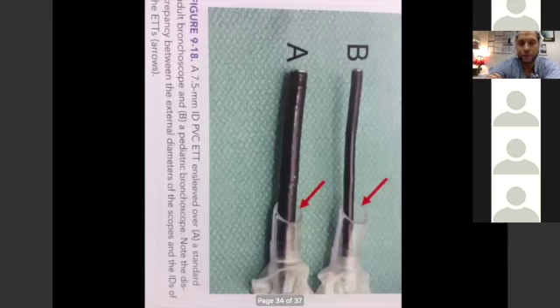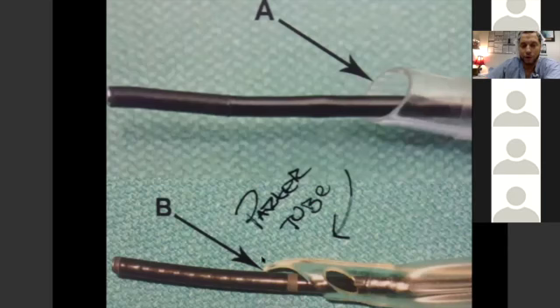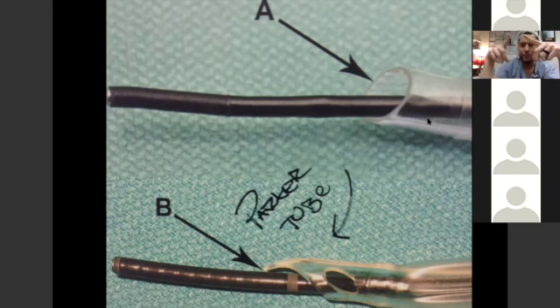Now, we have a tube, Georgina brought it for us, helped us order it. It's called the Parker tube. And the Parker tube hugs the fibroscope. So you see how this part in A would get caught up on the cords? The Parker tube will stick to the fiber optic scope and allow it to enter easily. So whenever I have the option, I will always use a Parker tube for my fiber optic intubation. So you want to have your tube loaded on the fibroscope. You bring it all the way to the top of the fibroscope. You can put a little piece of silk tape to hold it there. Usually you don't have the end piece on, you have that on the side, but make sure you have it available because you will need it.